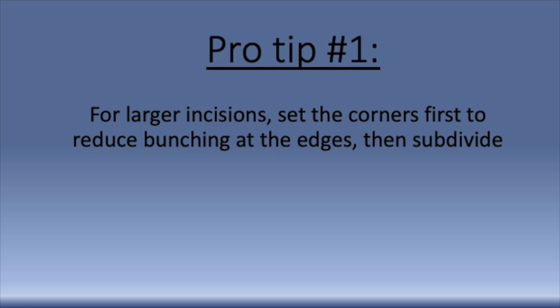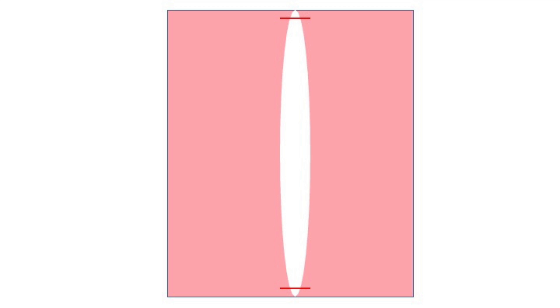So that's the basic technique. Let's think about a few more complicated situations. When you are approaching a larger incision, one good way to start the closure is first by setting the corners. This means placing the suture at the top and bottom of the incision. This helps flatten the corners and prevent dog ears.